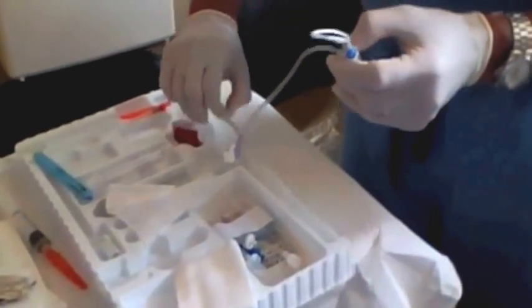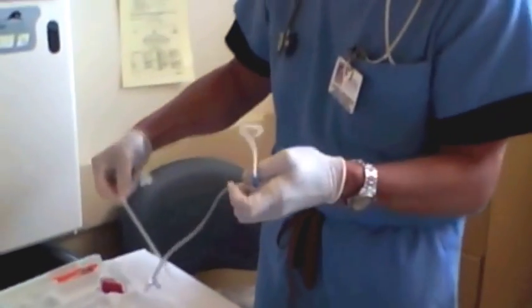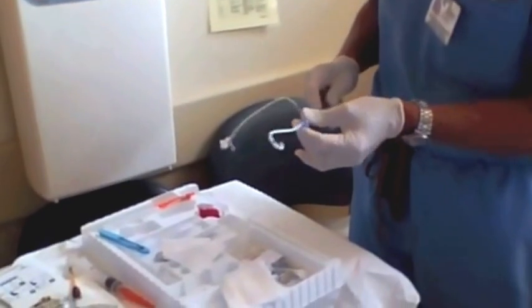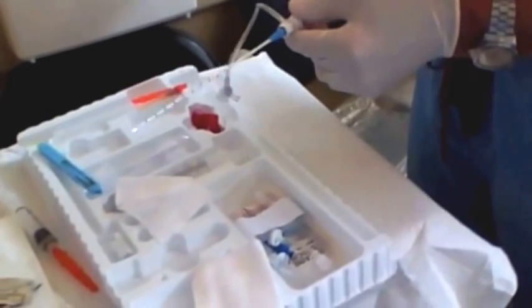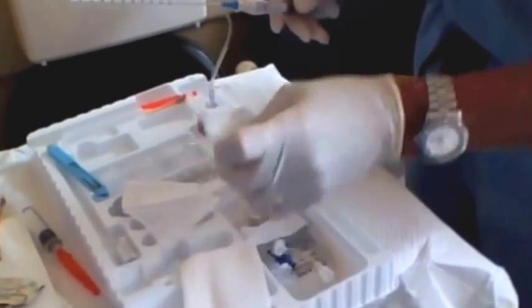The catheter itself is a pigtail catheter — it's a small little thing — and there's a trocar that goes through it. When you take the plastic sleeve off the trocar with the kits we're using, make sure you take that little plastic piece at the bottom off, otherwise the catheter won't go all the way on. When you slide the catheter on, you can see it's straightened out by the trocar. There's also a syringe and a stopcock set up at the end.